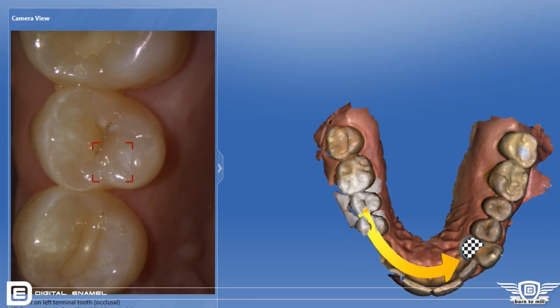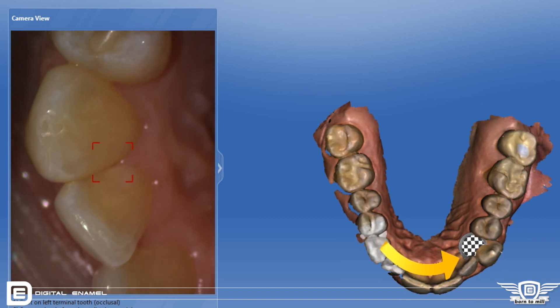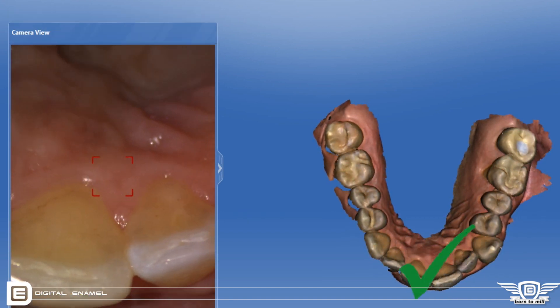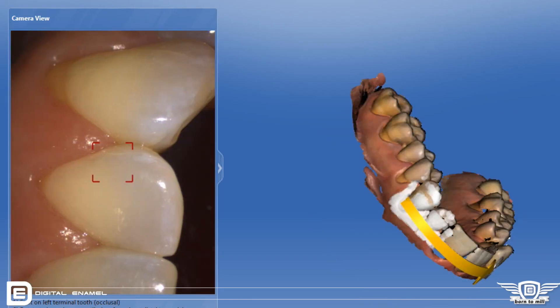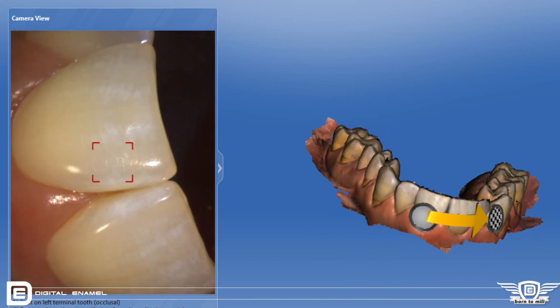The software automatically registers the tooth — it sees it, does a countdown, and then you just glide the camera where directed. You get to an endpoint just across the midline, build that one quadrant up first, and then move over to the next quadrant.